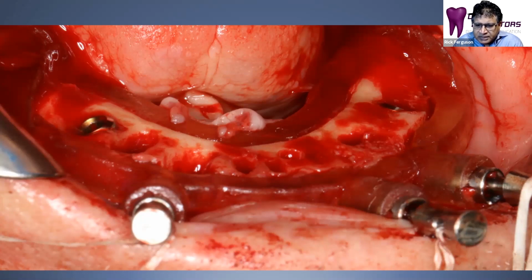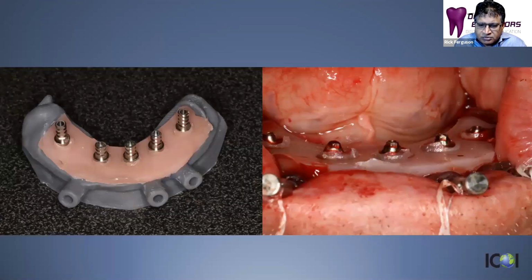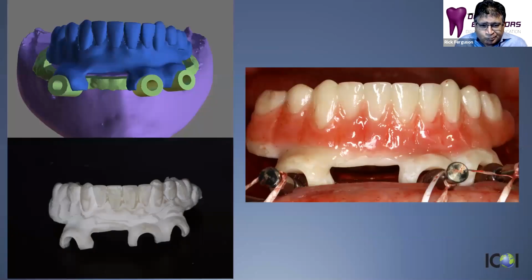The 2 distal implants are going to be at a 30-degree angle to match up with 30-degree multi-unit abutments so that everything becomes parallel. The implants in the anterior are typically going to be parallel to each other, if we can get them parallel to each other, depending on the volume of bone we have. And then the distal implants are angled 30 degrees or 17 degrees, depending on what you choose to do based on your existing bone anatomy.